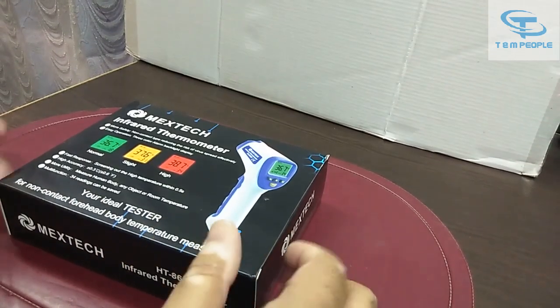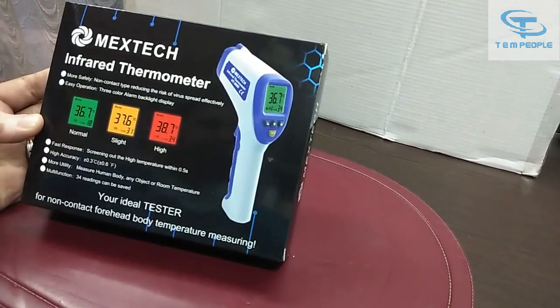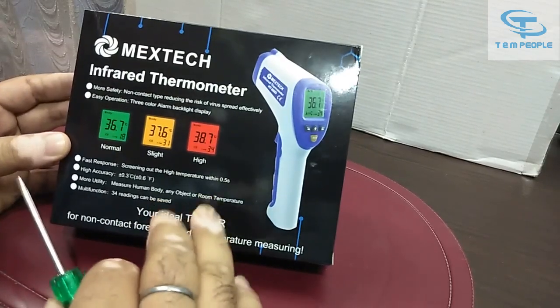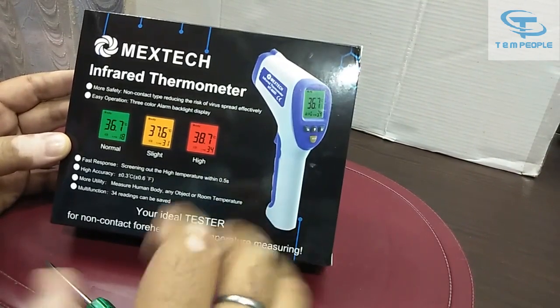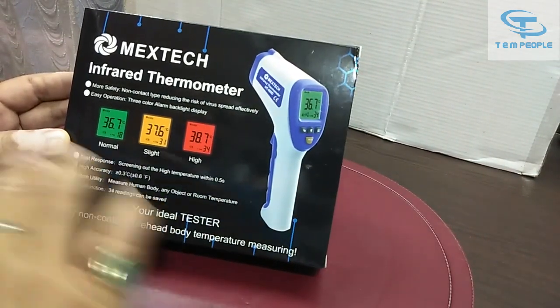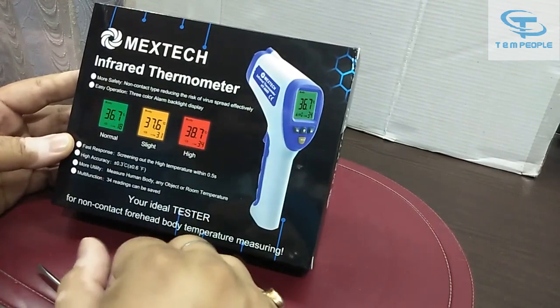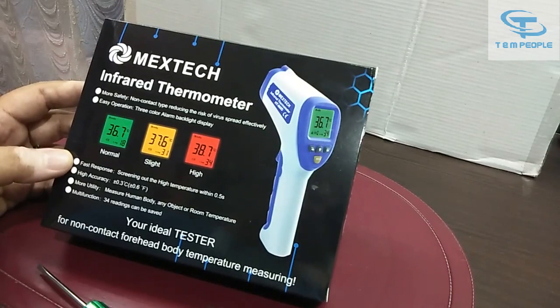My name is Rohit and today I will be demonstrating this thermometer. This is an infrared thermometer, the make is Mextech, and it is for human body use. You can also use this instrument on surfaces — you have to change the setting. I will give you an in-depth demonstration, including how to change from degrees Celsius to Fahrenheit and back. So let's start.